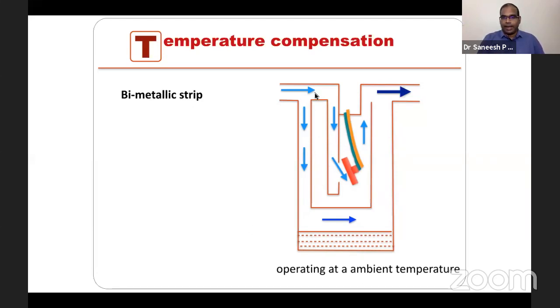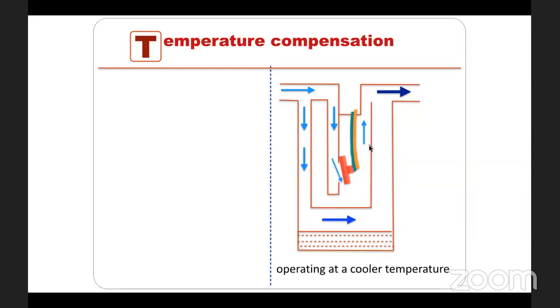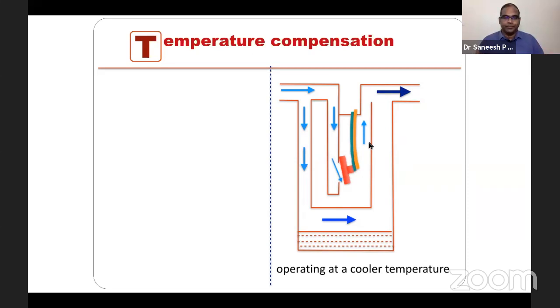So here, first you can have the vaporizer here. So this is the bypass chamber. So initially the metallic strip is positioned like this. It escapes and a portion of the carrier gas goes into the vaporizing chamber, takes vapor and joins the outlet. Okay. Now what happens when cooling occurs? In the operating room, as vaporization happens and the liquid starts to cool, this one straightens and almost reduces the opening for the bypass gas. So what will happen effectively? More of the gas will be pushed to go into the vaporizing chamber and take the vapor.